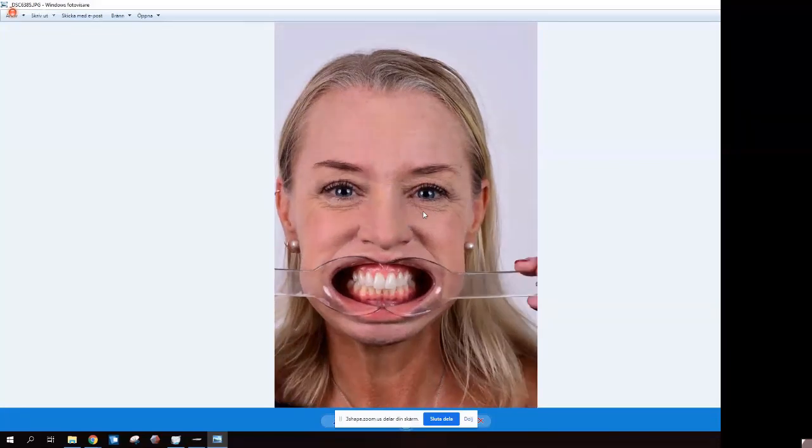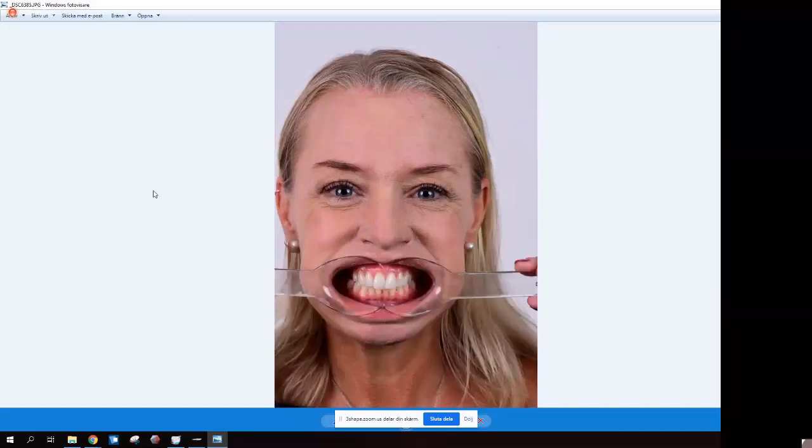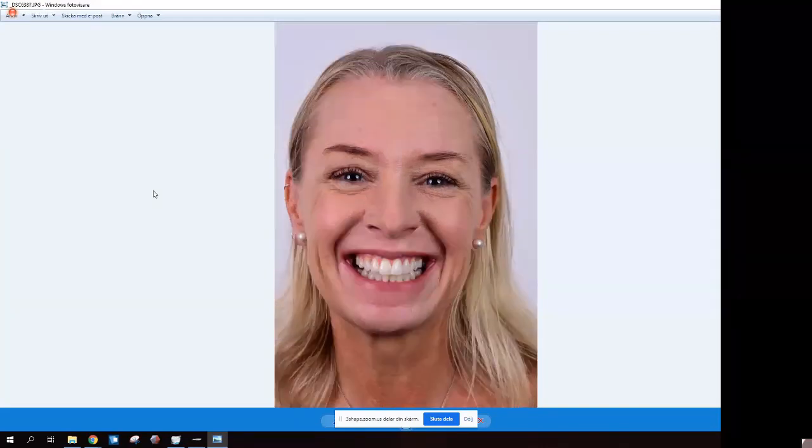And there is one cool thing, because here we took the sequence of this patient in the following order. So we took this picture first, then took the retracted, because it was a little bit off-center. However, if you look now, after these retracted pictures, we always take one more full face. So basically the patient holds the retractors by herself, and then she removes them.